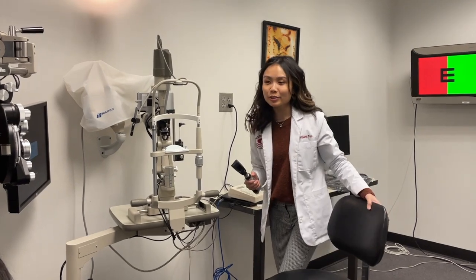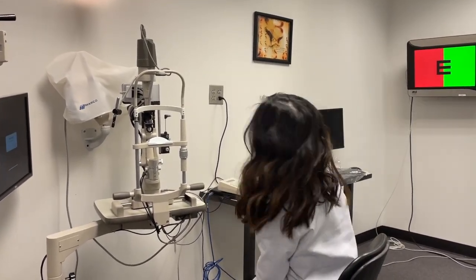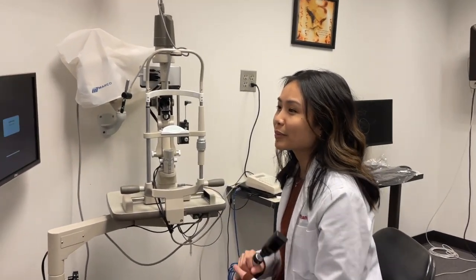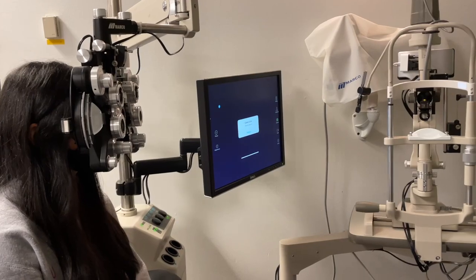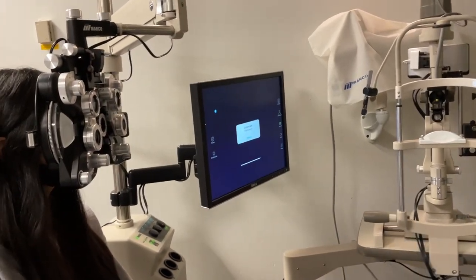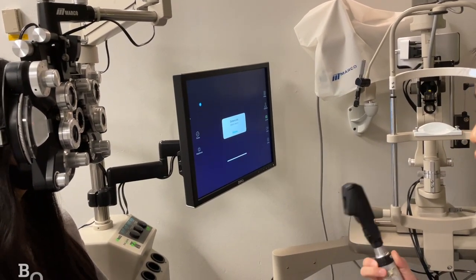Alright, Mrs. Lee, I'm now going to be getting a rough estimate of your prescription. So I'm just going to have you look right there at that big letter E. There will be times I may cover the E, but let me know if I covered the E completely. I'm going to go ahead and turn the lights off. Ideally, it would be dark in here, and then you would state your working distance. My working distance is 50 centimeters.